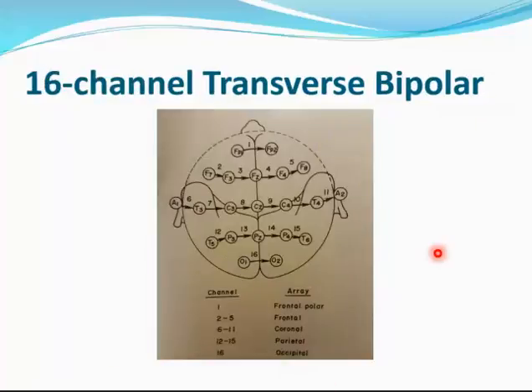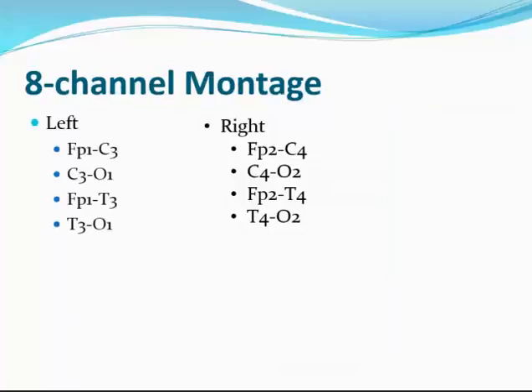And here we're showing a 16-channel bipolar montage displaying 5 coronal planes arranged in anteroposterior order. This is visible and very clear, as you can see from the figure. In our practice, we use at least 8 channels if EEG is one of the main modalities that we're monitoring.